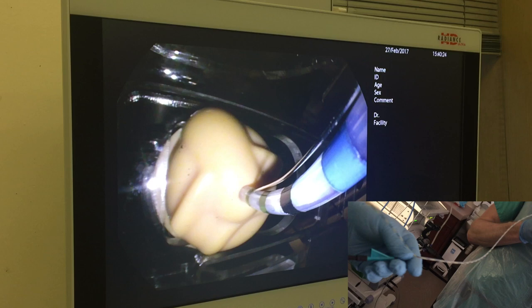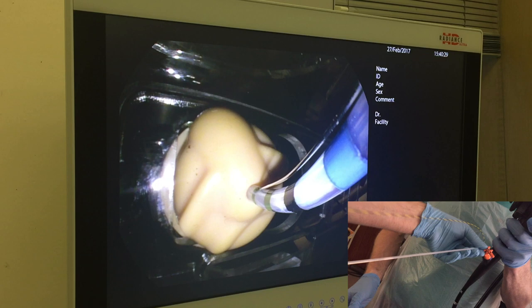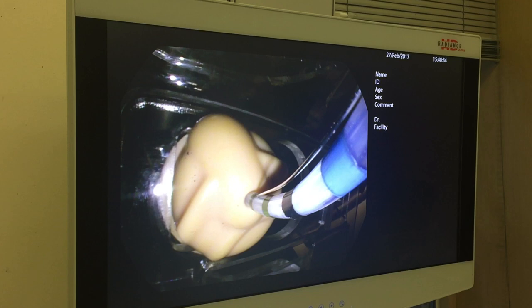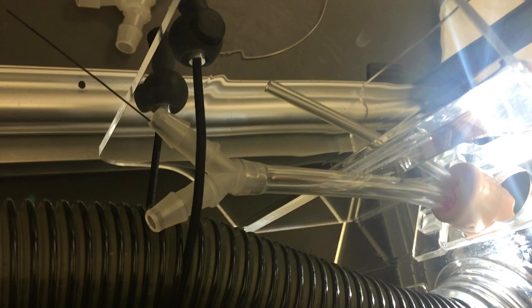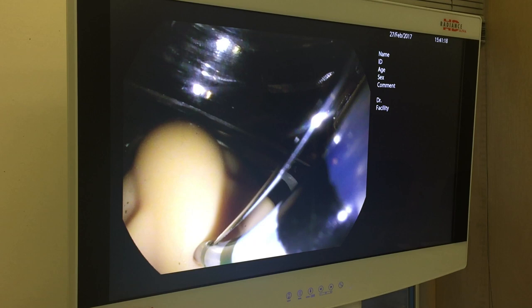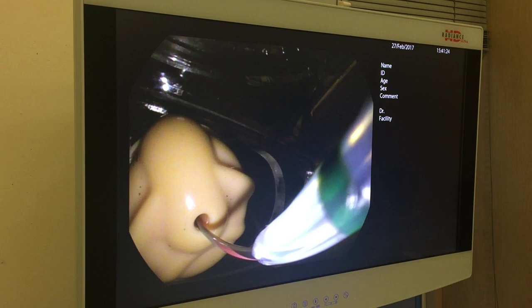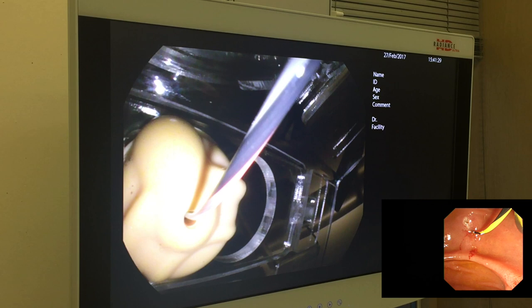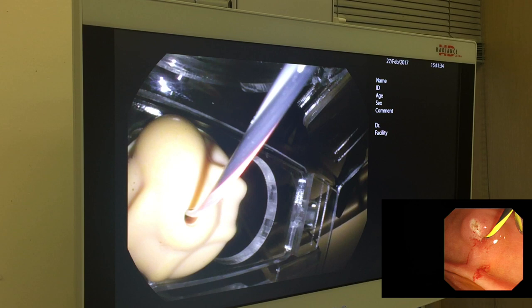So if Ann can strip the wire — you can see that the orientation of the catheter or the sphincterotome in this case is matching the CBD axis and you can see the wire sliding inside the papilla and hopefully accessing the common bile duct. If you go down now to the fluoro image you can see that the CBD is staying nice and close to the papilla as we withdraw the sphincterotome. We're slowly withdrawing and as we withdraw the sphincterotome we'll reveal the bare stripe guide wire, and when the sphincterotome is back in the scope we'll just secure the guide wire by closing the elevator and then we can do a rapid exchange with a short wire system until there's resistance back at the working channel around five centimetres.